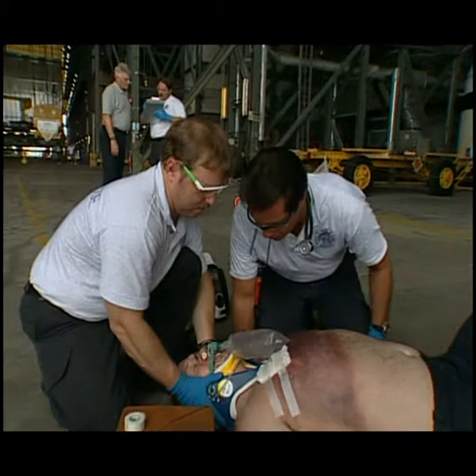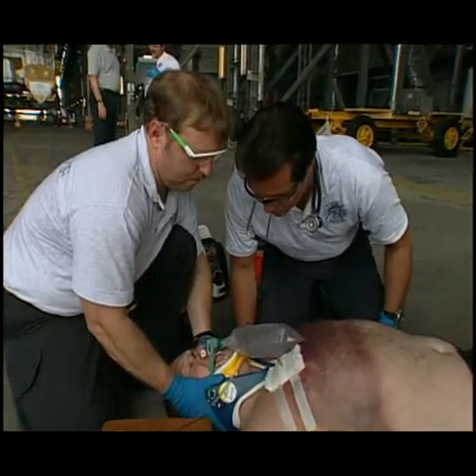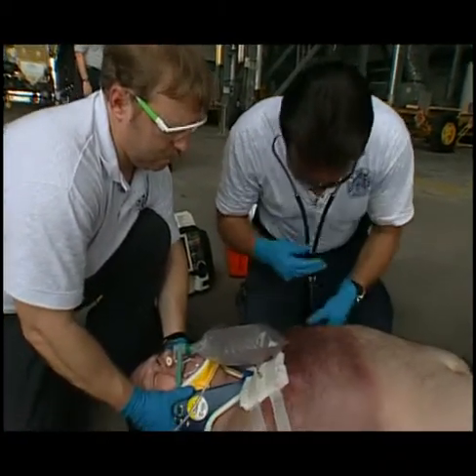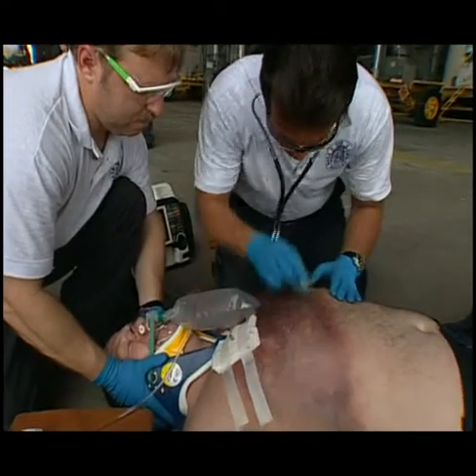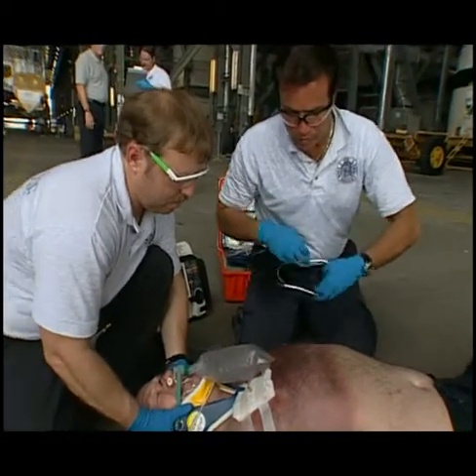Mark, how you feeling now? Other than having this needle protruding from my chest, I'm feeling better. Okay. Let me listen to you breathe again, okay? As always, check with your medical director and your agency's policies and procedures regarding the treatment of the patient with a possible tension pneumothorax. Still diminished on the right, but a lot better.